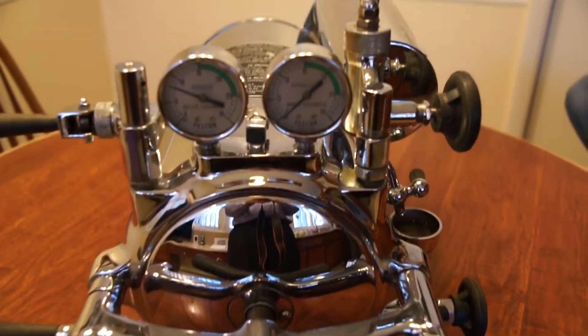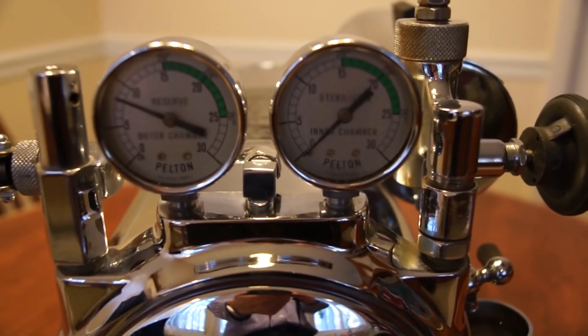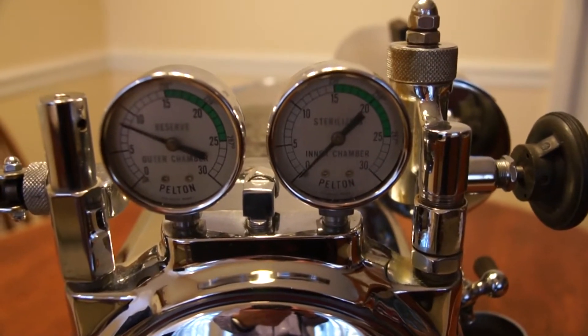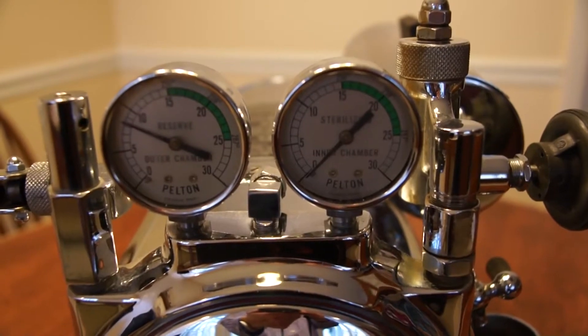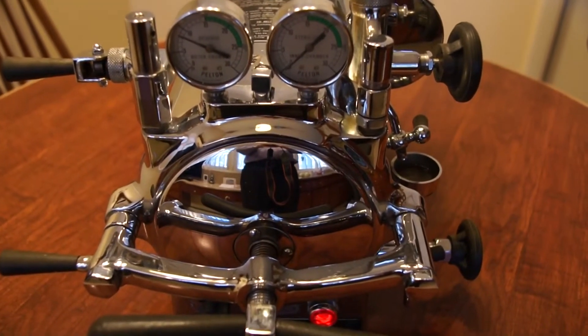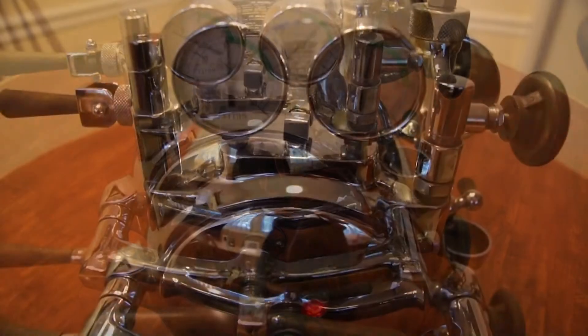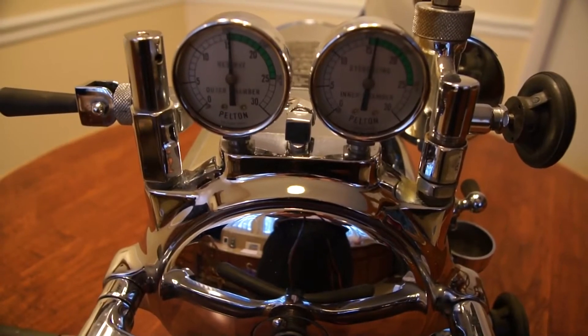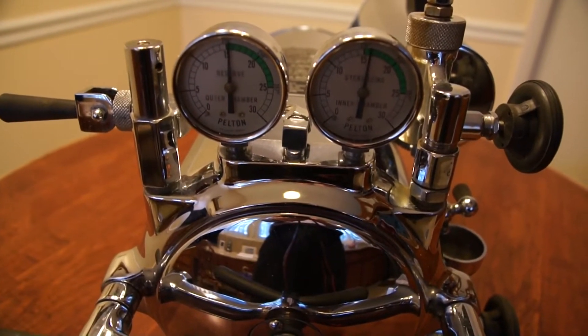You can see now that our outer chamber has reached about 8 psi. At this point the inner chamber is still zero, but in just a little bit the inner chamber should start building up pressure. We will wait for both to reach 15 psi before we start our timing of the sterilization. You can see that both gauges now are past the 15 psi, into the green zone.